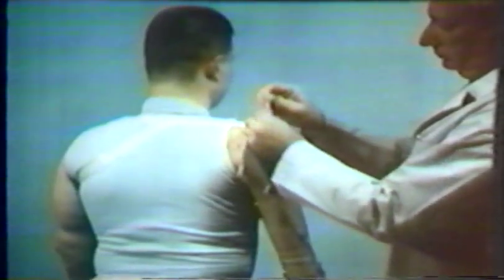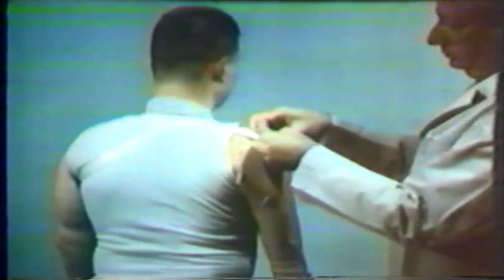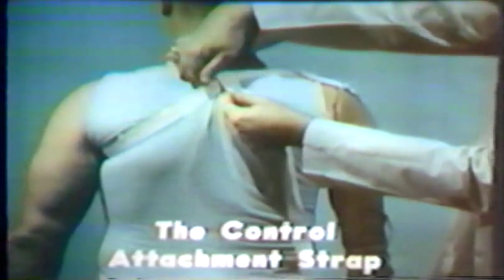The fourth part of the harness is the control attachment strap. Taking its origin from the axilla loop, the control attachment strap passes below mid-scapular level and attaches to the proximal end of the elbow flexion terminal device control cable.